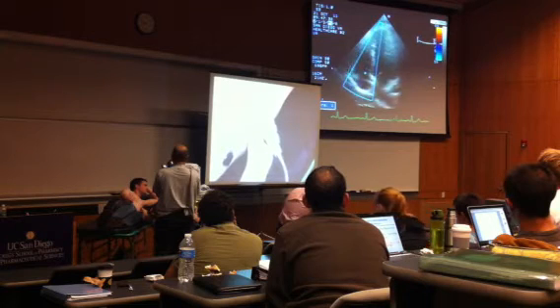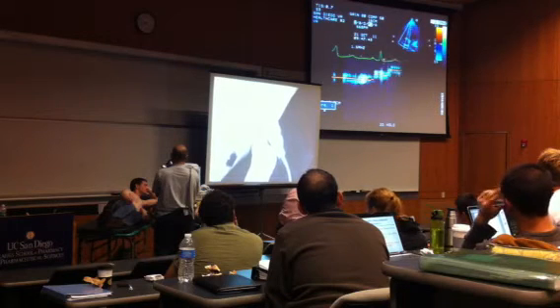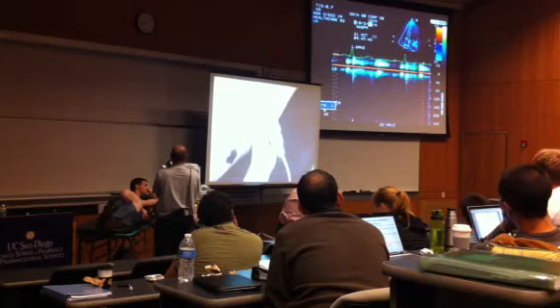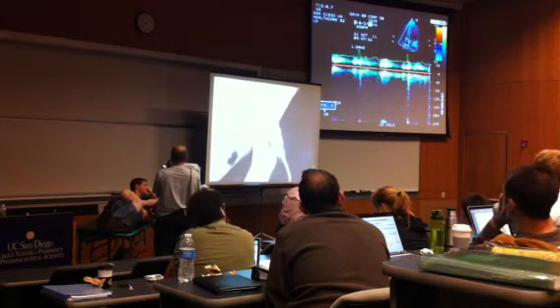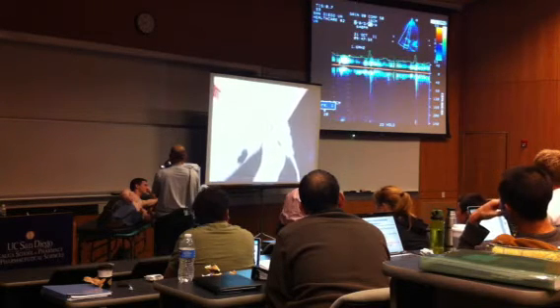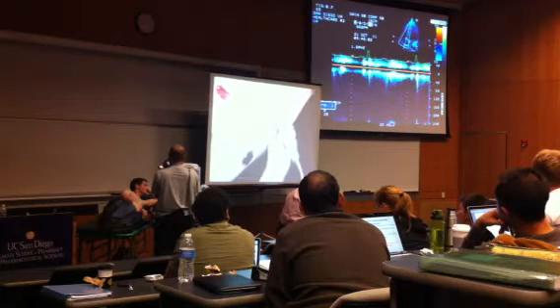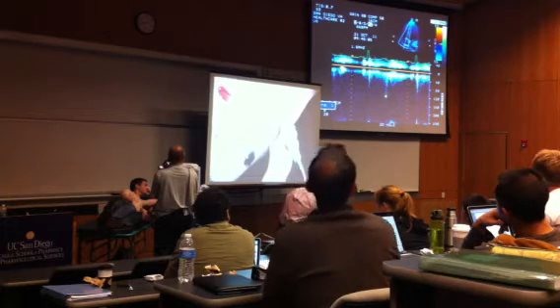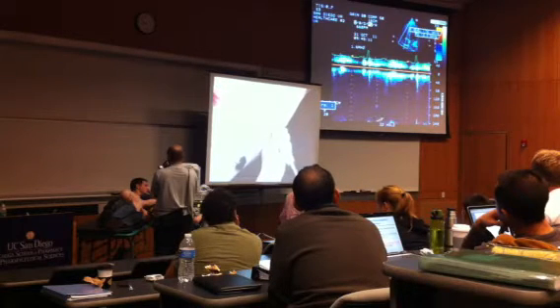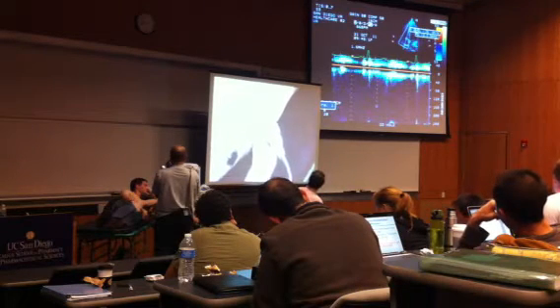So beyond the color flow Doppler, there are other modalities, one of which I showed you with that aortic valve, such as continuous wave or pulse wave Doppler. I'm not going to go into the nuances of it. One is basically transmitting and receiving a signal continuously; we generally don't image. Another sends it out and then waits for the signal to come back, the pulse, and we listen to it, as we're doing here. We see this tiny little signal here, and that likely is the tiniest squirt of tricuspid regurgitation. It's not as clear as that one I showed you for one of our other patients.